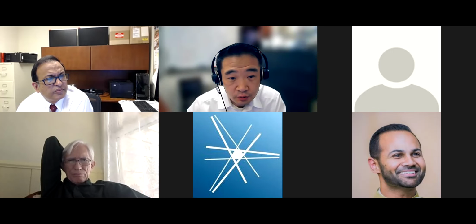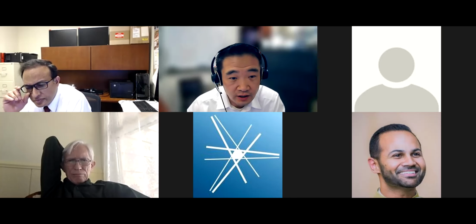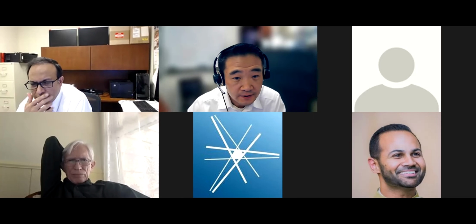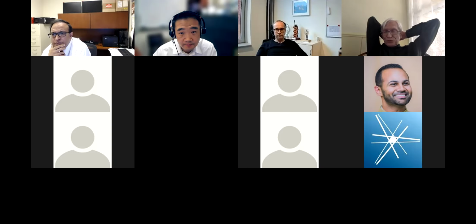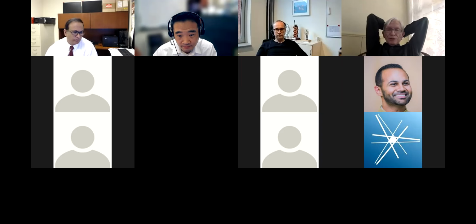Thank you. Bruce, do you have any other final recommendation or comment for RayStation? No, I think you all have had pretty good comments. I think the system has thought of a lot of the things that are necessary. It'll become more obvious as more people use it.